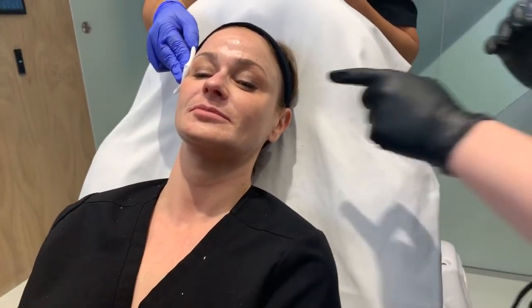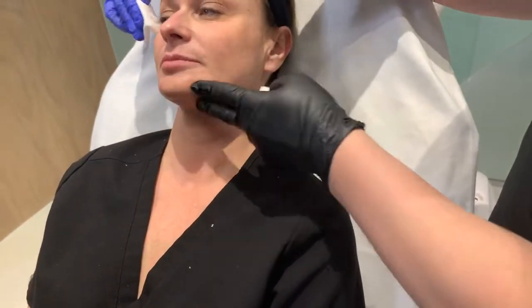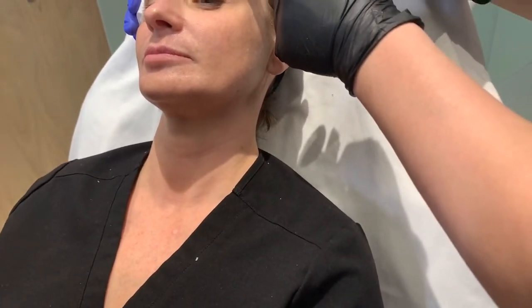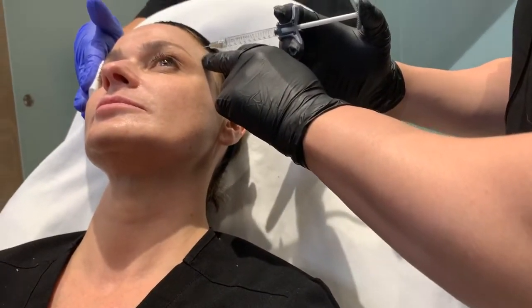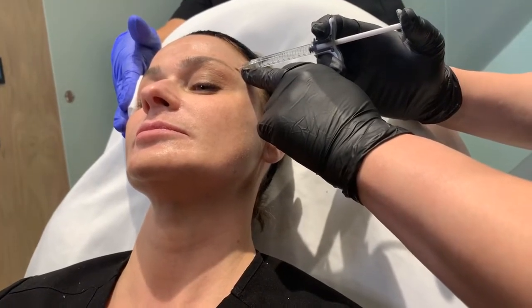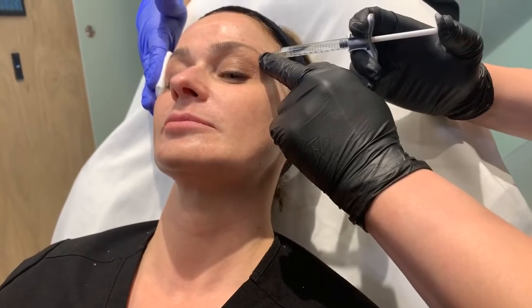Now to balance what we just did, we want to give her a little structure and lifting through the jaw. And we also want to lift a little bit in the brow and give her support. So we're going to do a little filler along here, very small amount. We're going to use Voluma. And we're going to go into the brow, right into the ridge of the brow. Just do a little bit because she's looking a little thin there, a little slim.